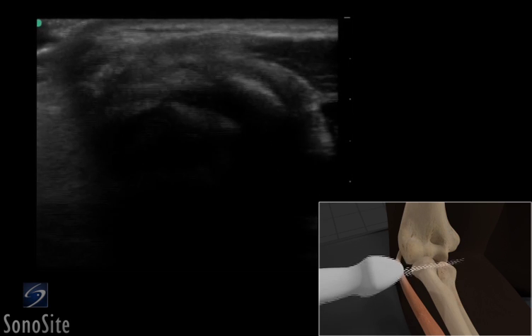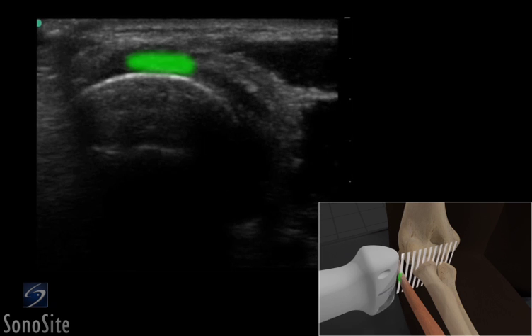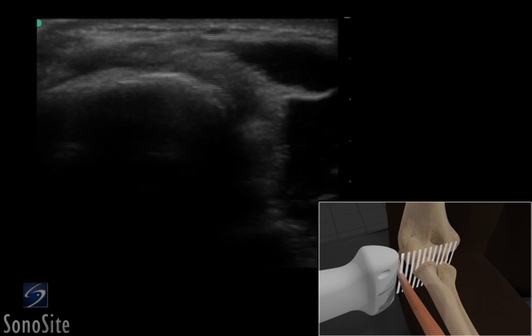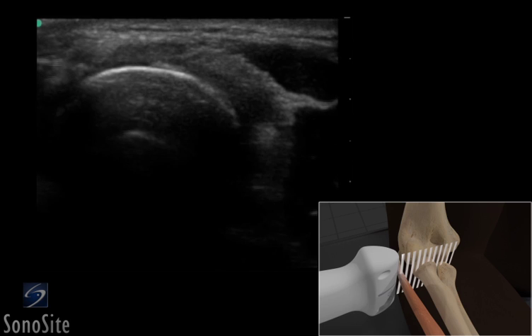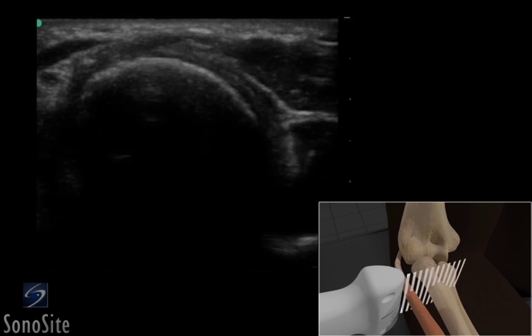The transducer is then turned 90 degrees counterclockwise for a transverse image. The extensor tendon overlies the hyperechoic radial head. The articular cartilage can be seen as a thin, hypoechoic line overlying the radius. The transducer should be moved distally to evaluate the entire tendon and joint space for evidence of loose bodies or tears.